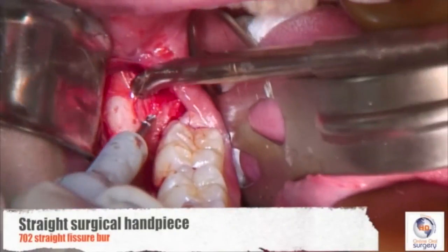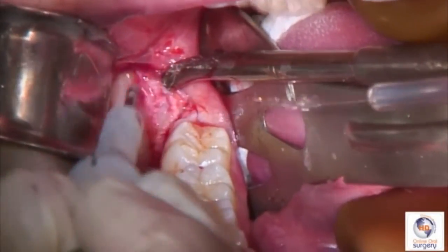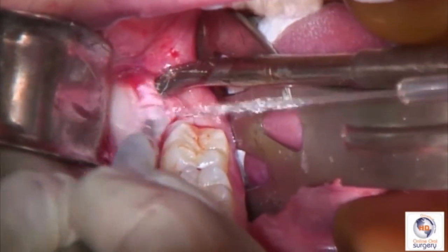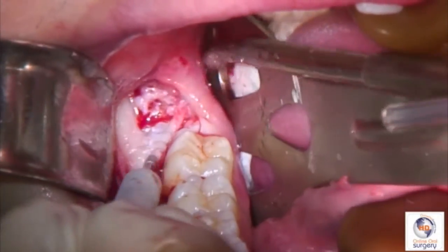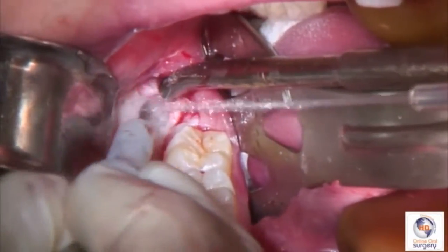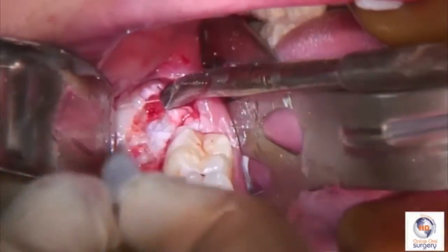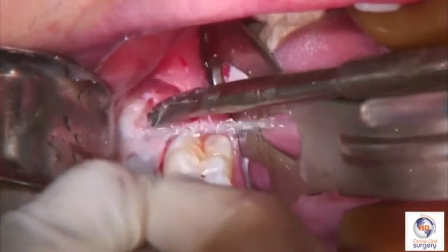We now begin our procedure using a straight surgical handpiece. In this case, I'm using a 702 straight fissure burr with lots of irrigation, and kind of using the burr as a paintbrush, just painting away lightly with very light pressure, just painting away the bone that's covering tooth number 32. I'm going to go over the full extent of where the tooth is hiding. As I start sweeping away the bone, I will begin to see the tooth, and that will help me as far as where I'm going to be further removing the bone.